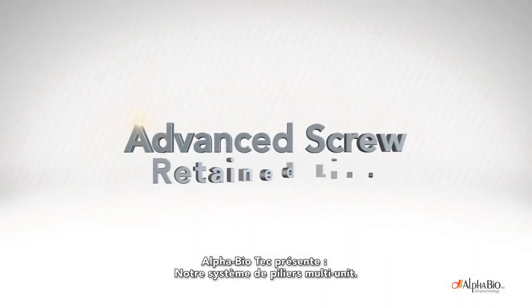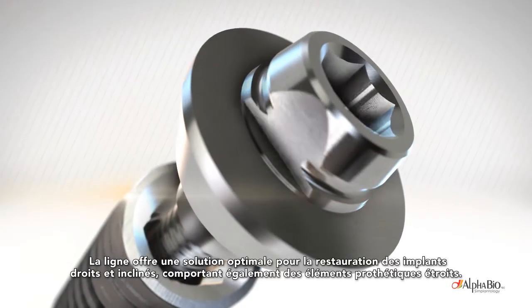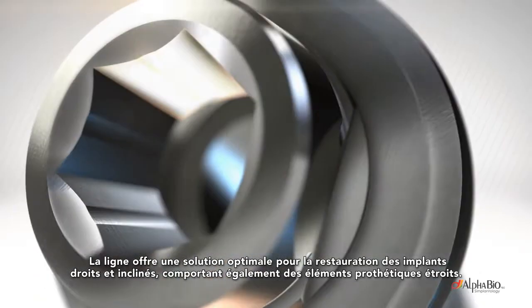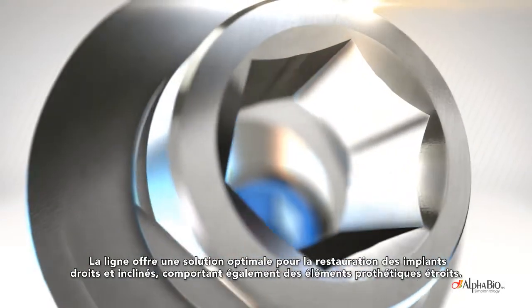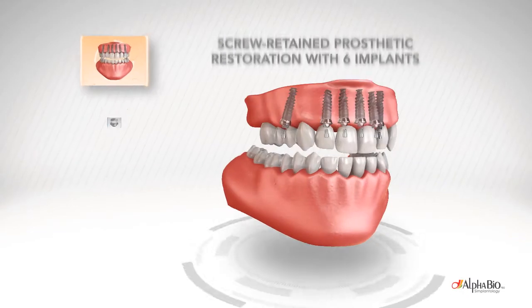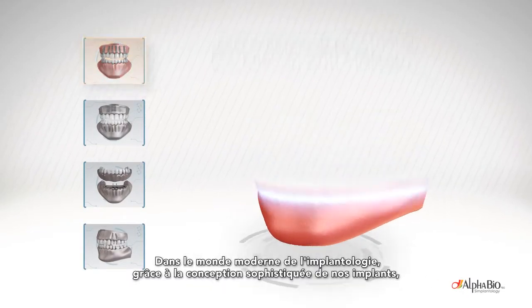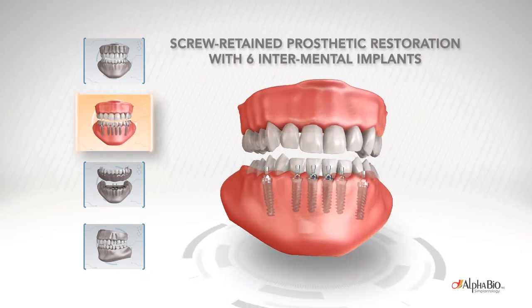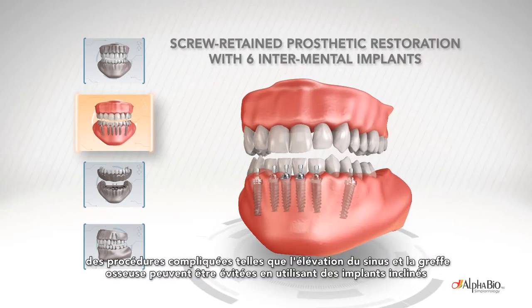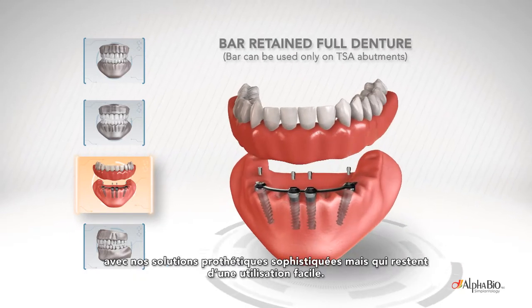Alpha-Bio Tec presents our Advanced Screw Retained line of products. The line provides an optimal solution for restoration on both straight and tilted implants, also featuring narrow prosthetic elements. In the modern world of implantology, thanks to the sophisticated design of our implants, complicated procedures such as sinus lift and bone grafting can be avoided by using tilted implants with our sophisticated yet easy-to-use prosthetic solutions.